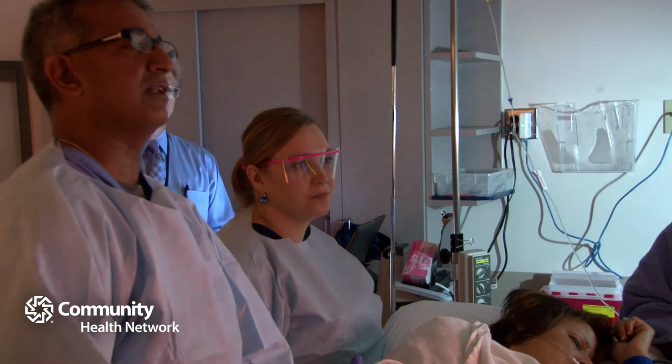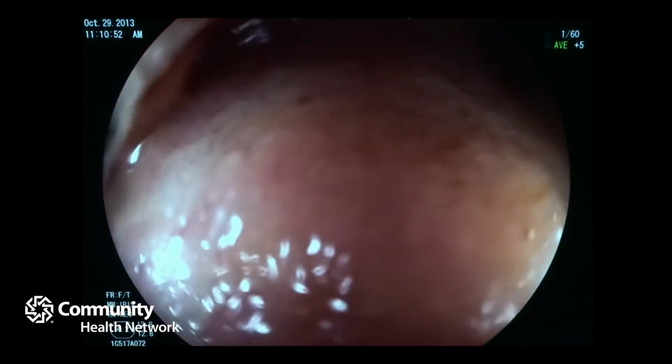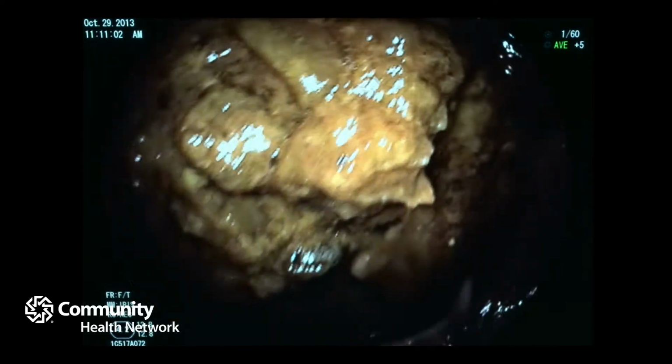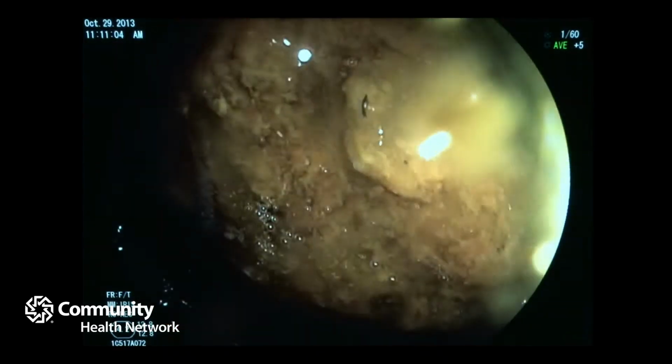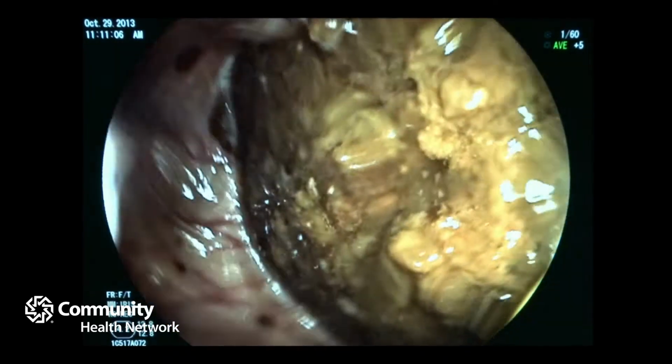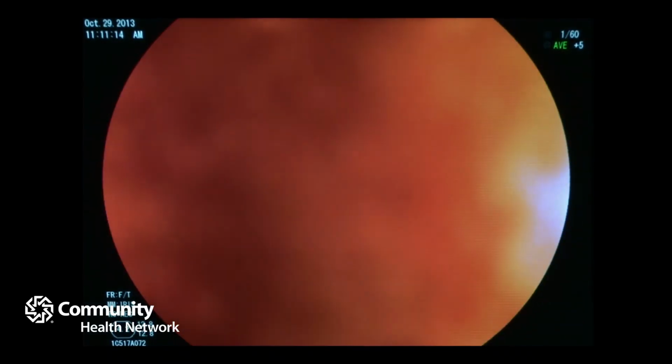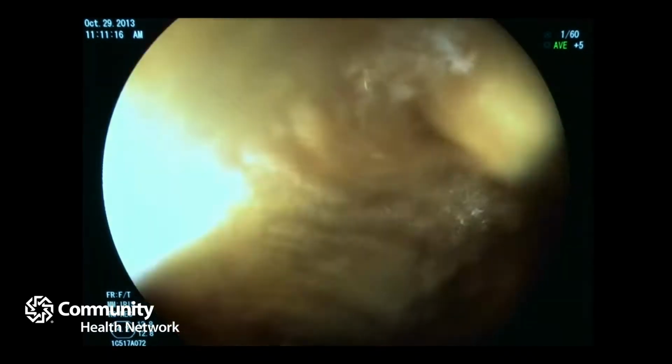So this is the ileum. There. So this is how I know that I've made it all the way. There we go. So this is something you can just use as a marker, or sometimes you'll check that for people with Crohn's or colitis or things like that. And that's how you know that they have disease there. So yeah, it's basically 10 years earlier than when the family member was diagnosed, or no later than age 40.